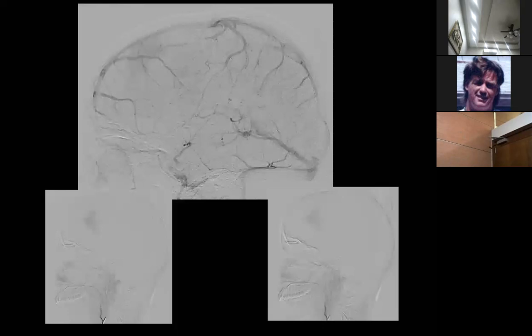Sure. Okay. Actually, that's what we did. Hazem and I sat there in front of the screen and looked at the angiogram and we debated whether we should embolize that branch coming from the ophthalmic, which is a young lady, so we did not want to take that risk. So we ended up taking those branches from the anterior cerebrals and from the middle meningeal.